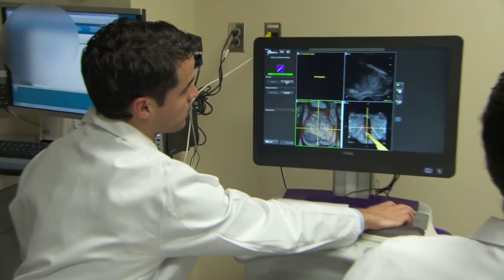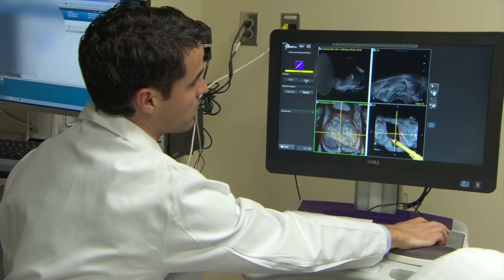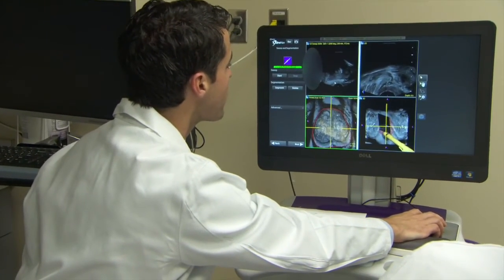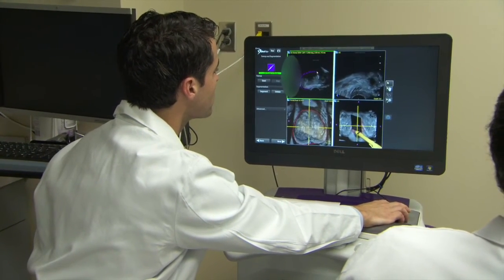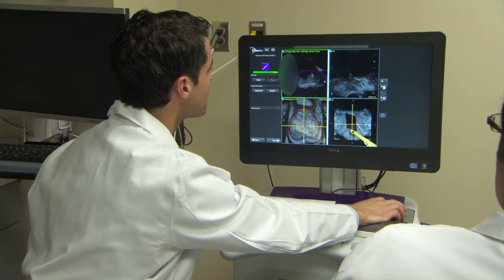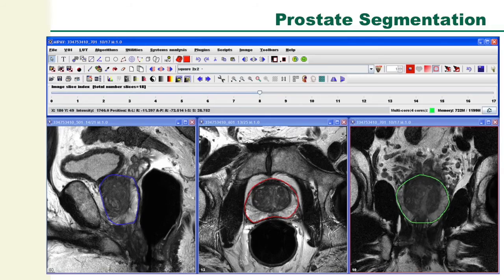As we're going through this, we're able to segment the prostate based on the real anatomic prostate images and then fuse that to the ultrasound in both a rigid and an elastic registration setting, because this gland is not rigid. There is some deformity to it, which is something that the software as well as the clinician can build into their procedure. As you can see here, the imaging performed by MRI in 3 different planes. The axial, the sagittal, and coronal imaging is segmented as Dr. Nix described. This allows for identification of areas along the edge of the prostate, as seen here.